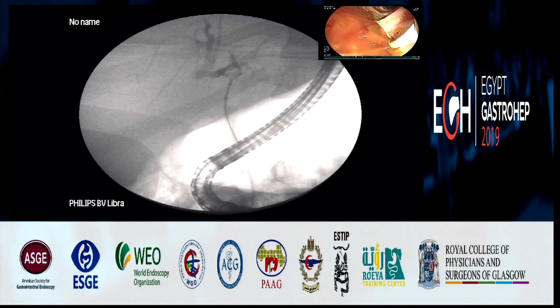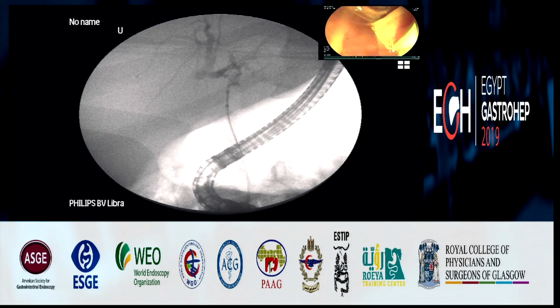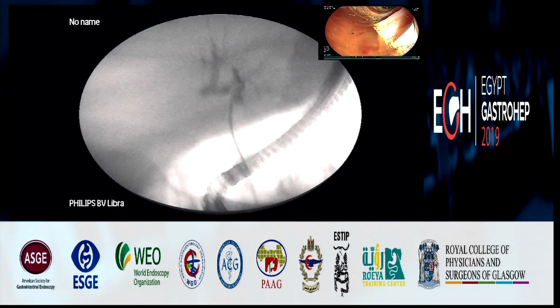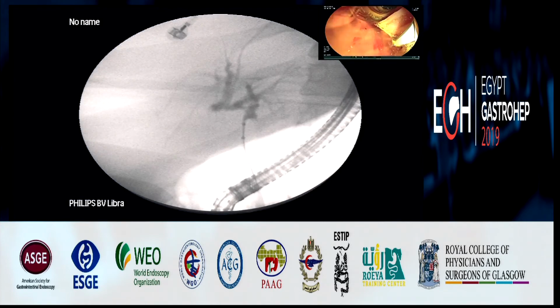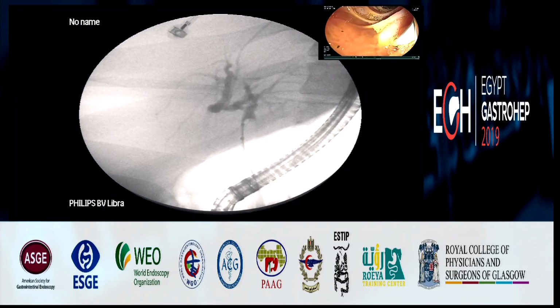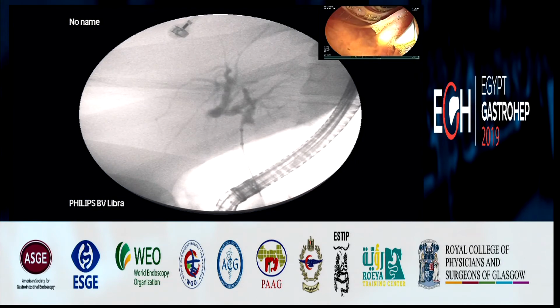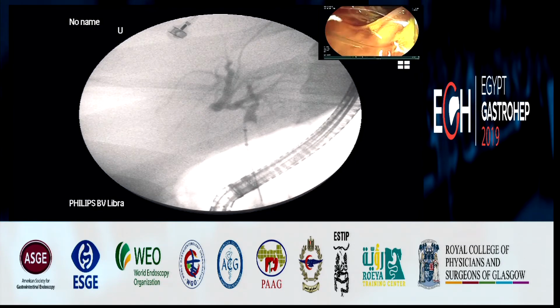Yeah. Going to inject a little bit more contrast just to have a final view, and then we'll extract the balloon. So it's mostly on the left side, but there's no stone, huh? No. Okay, so we will go down.